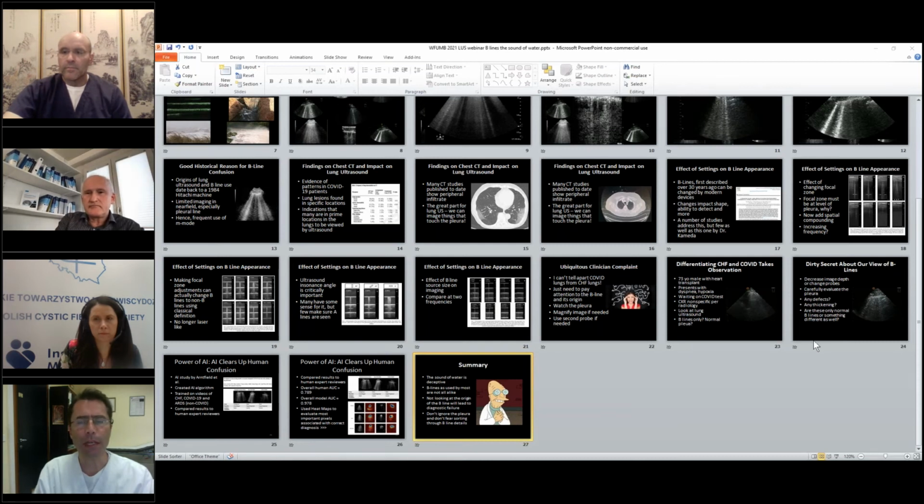We different ultrasound societies have already listed the number of examinations and the time to learn when you attend the practical courses attending ultrasound centers. And this is quite easy because ultrasound offices perform all examinations and receive patients coming from other wards.